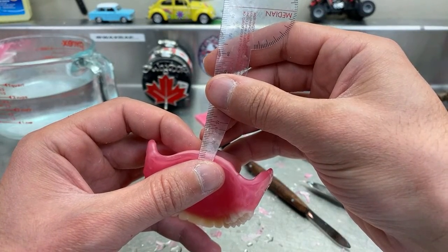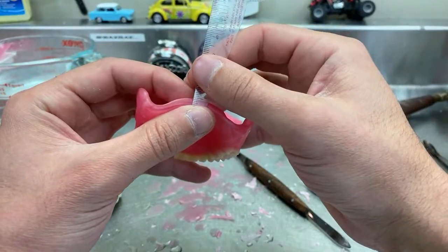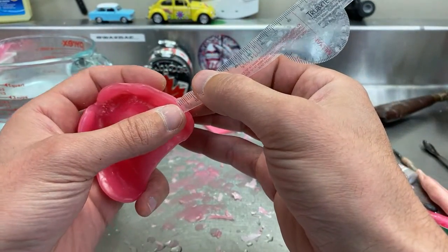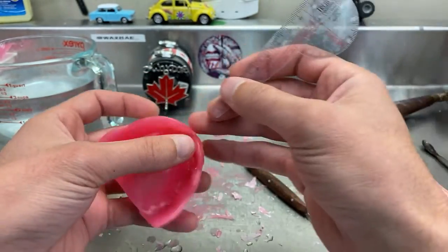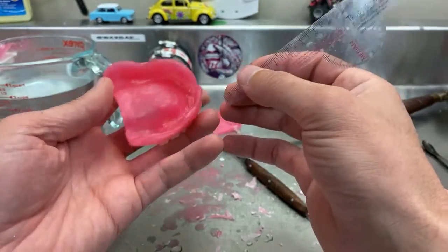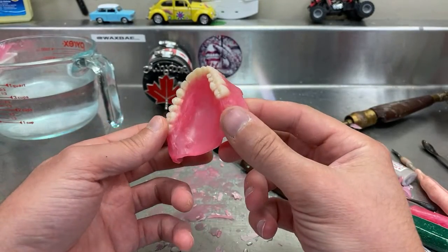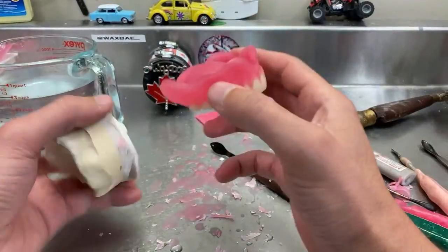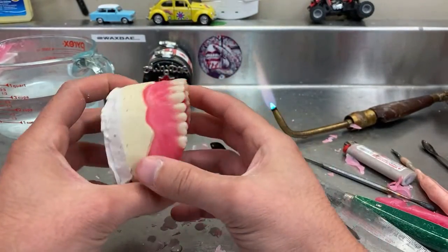So we're looking at 4 to 5 millimeters. So yeah, I'm keeping it thick all around, kind of here. These are 3 millimeters, 2 to 3, 2 to 3, 3, 2. So you should be safe with something like that because the thickness will hold in the patient's mouth. I don't think the patient's mouth will be that hot to actually melt this or distort it. Don't leave it for too long, of course. That's another thing. But keep it as it is here.